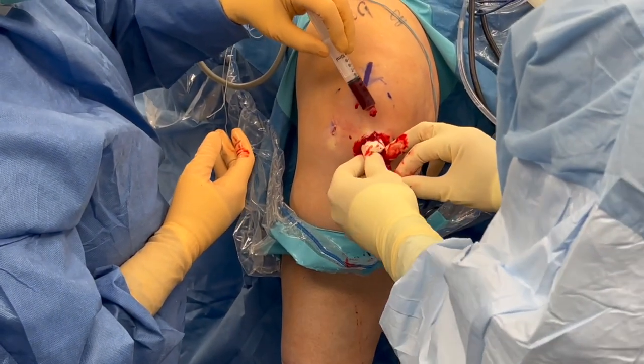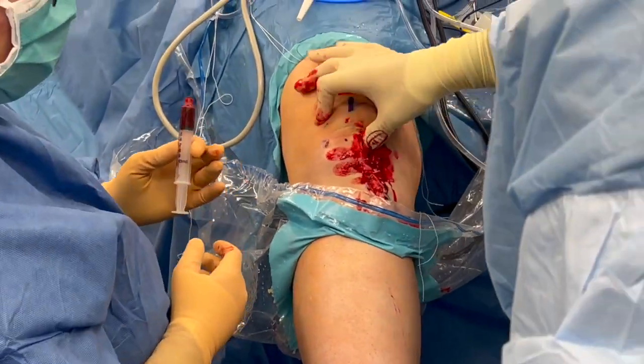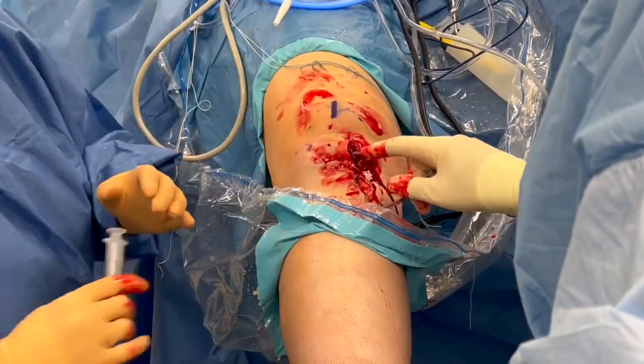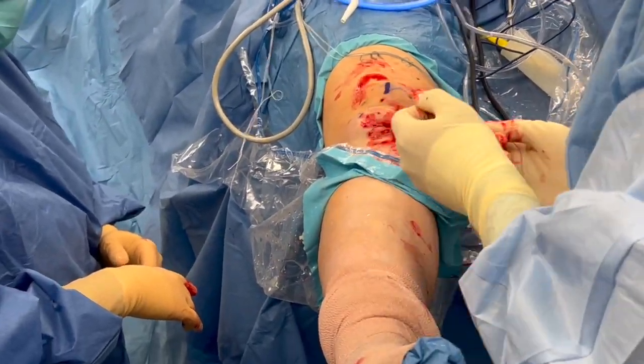We're going to go from the soft side in, with the hard side being pushed on. Then we extend the knee and bring it completely into the front of the joint right up to the femoral wall. Then we're going to engage the fiber tapes, which will secure the BEAR implant and finalize the internal brace in the knee.